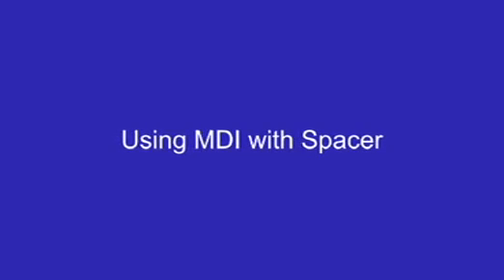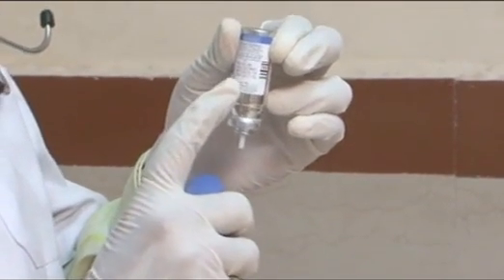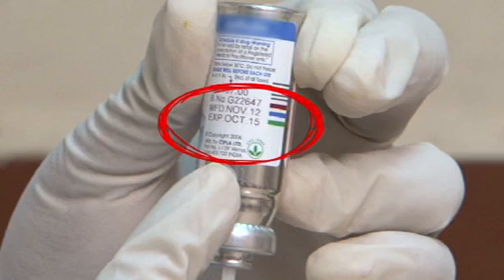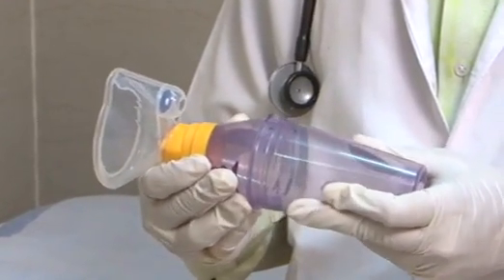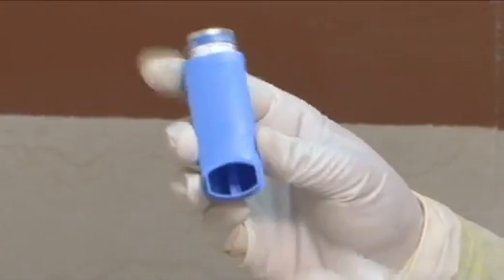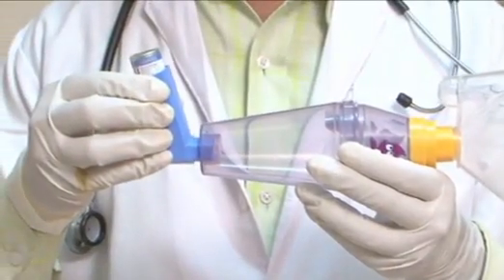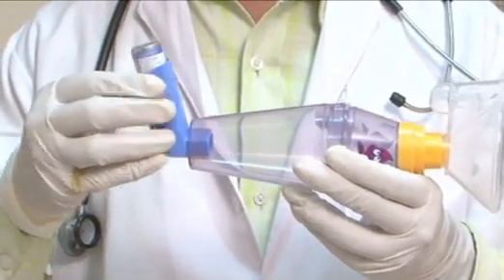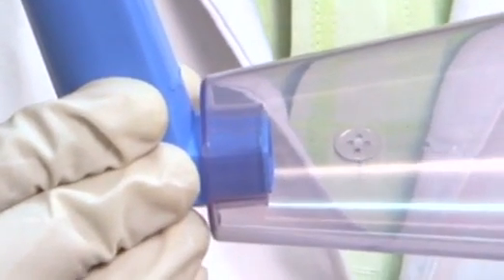Using MDI with spacer. Check the expiry date on the canister. Attach the mask to the mouthpiece of the spacer. Remove the cap from the inhaler and shake the inhaler well. Fix the inhaler mouthpiece into the inlet of the spacer. Inhaler should fit snugly and without any difficulty.